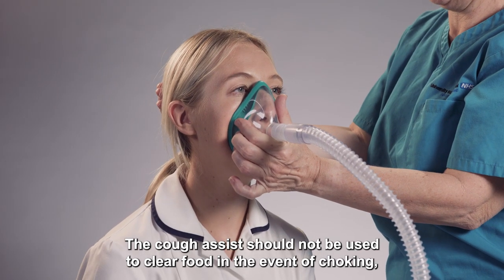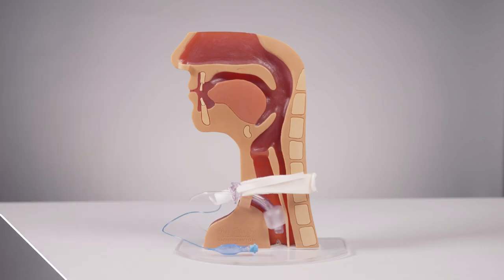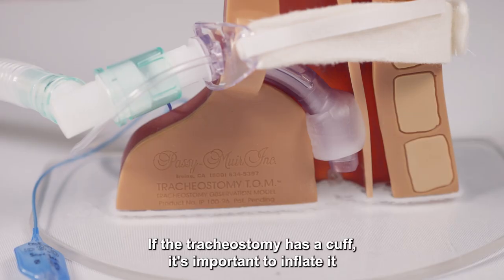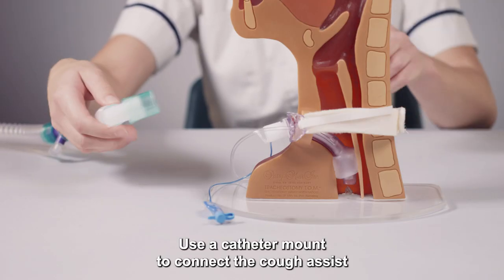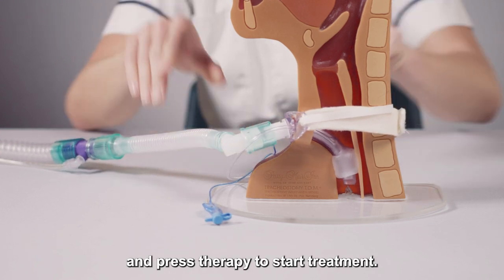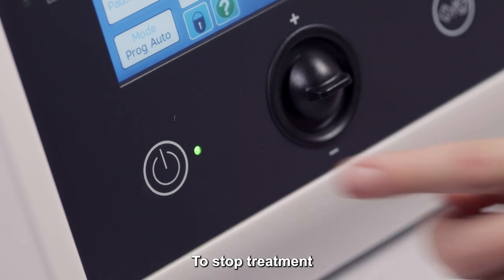The Cough Assist should not be used to clear food in the event of choking, as you can push the food further down the wrong way into your lungs. If connecting to a tracheostomy, use a catheter mount or tracheostomy connector. If the tracheostomy has a cuff, it's important to inflate it and reduce the amount of air leaking from the site. Use a catheter mount to connect the Cough Assist and press Therapy to start treatment.